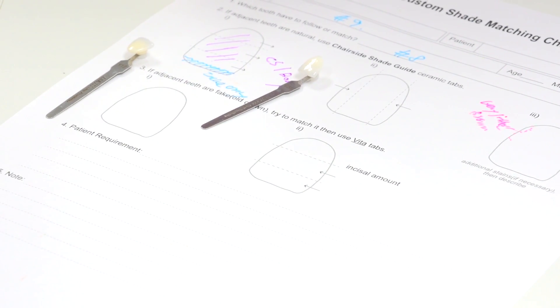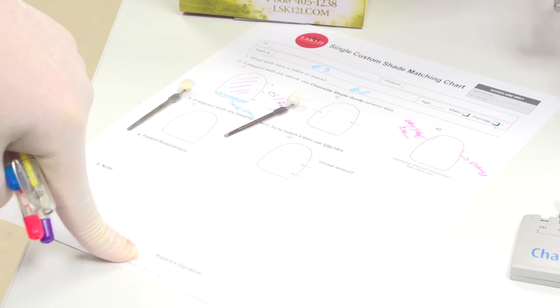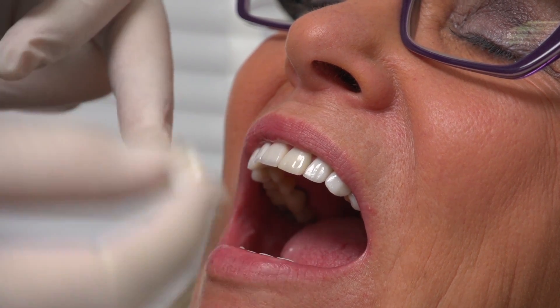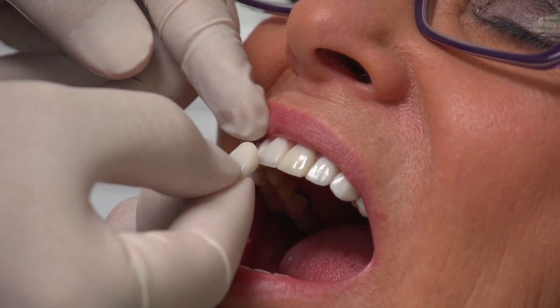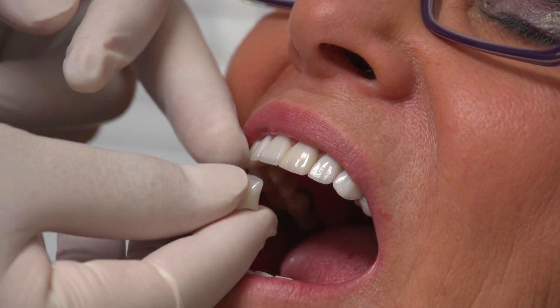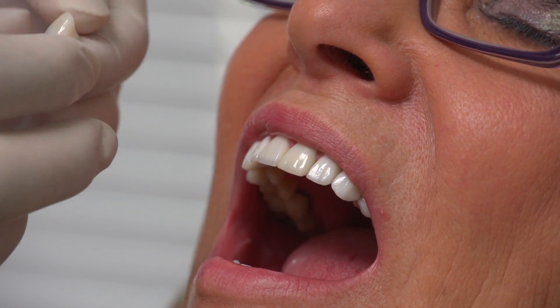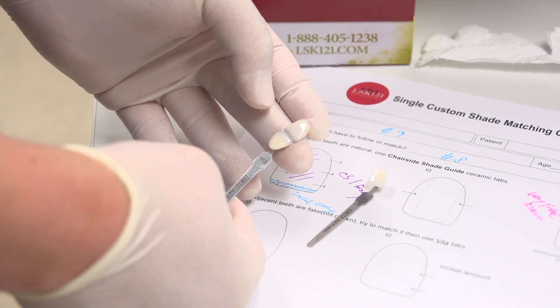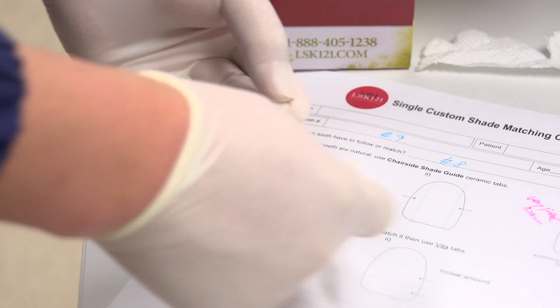I write down that the patient's tooth is to match the adjacent number eight, which is fine, and include the patient signature if needed. Then it goes to our production line, where we try to match the entire tooth — approximately 80% bleaching white color and about 20% transparency. For the incisal, I match about 10–20% transparency, and CS1 for the rest.